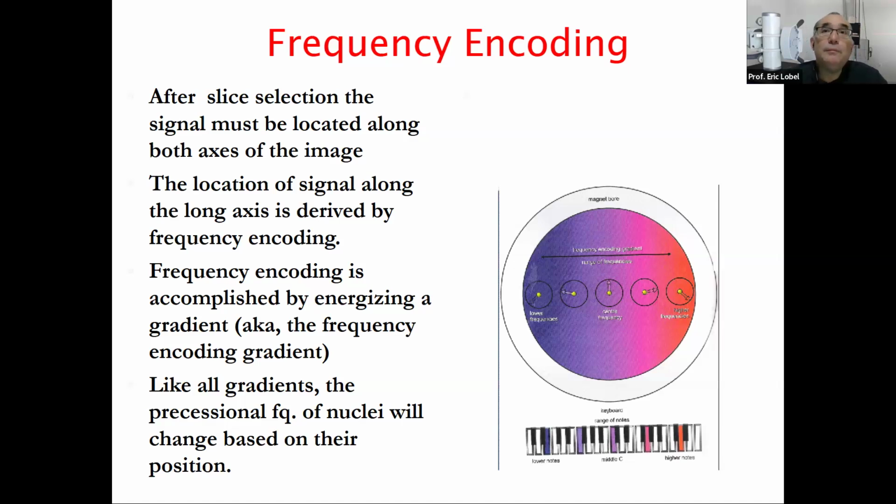So this generally remains constant in that we keep the same bandwidth and the same FOV, field of view, throughout the sequence, right? The two spatial encoding aspects that change the most is the phase encoding, right? Because that's filling K-space, and that K-space is going to represent one slice. Then the slice selection gradient will change once all the phase encoding has completed.